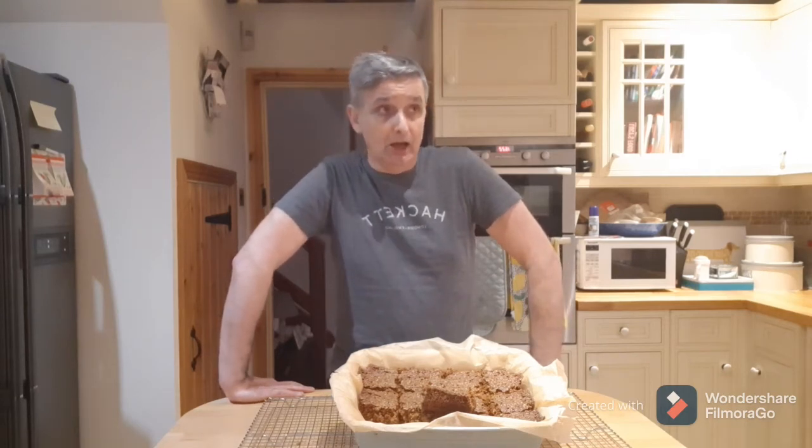Anyway, back to StomaCare products. I've had some new products delivered today. What I want to do is take you through what I've currently been using and then we'll have a look at these new products. So bear with me and we will have a look together.